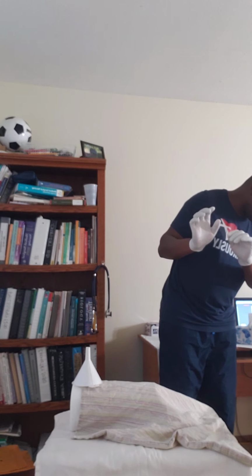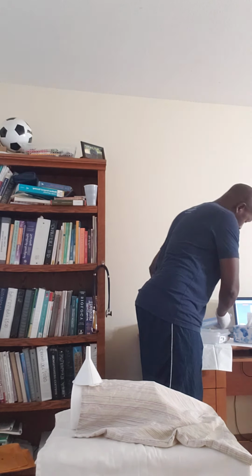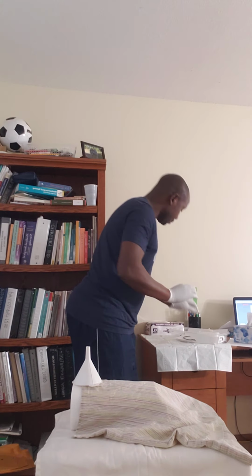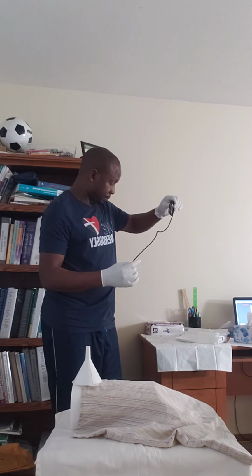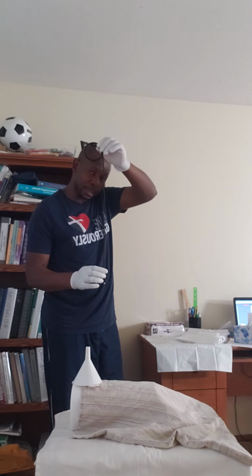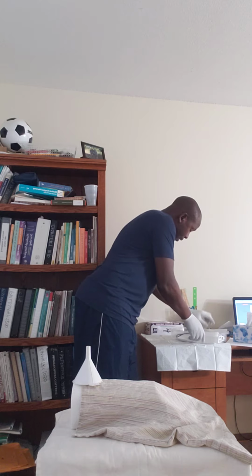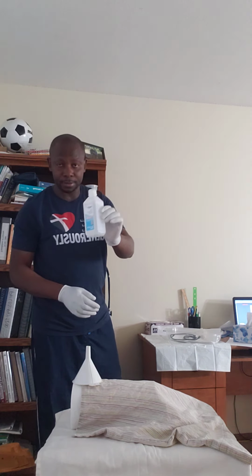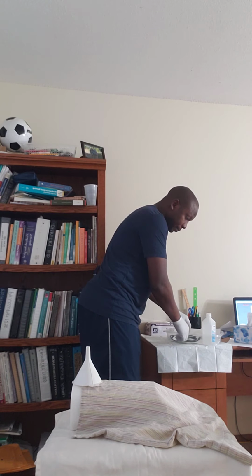I'm going to connect my kit. I don't know if I can be seen well. This is my kit. This is the suction, and here is the saline.